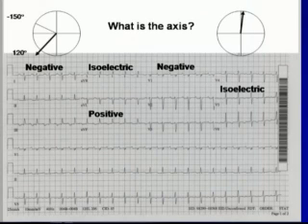So, yeah, excellent. That's 120 degrees. We're negative in lead 1, positive in AVF, which puts us in the right lower quadrant. AVR is isoelectric. It's at minus 150, so that gives us an axis of 120 degrees. You see, that's right axis deviation.